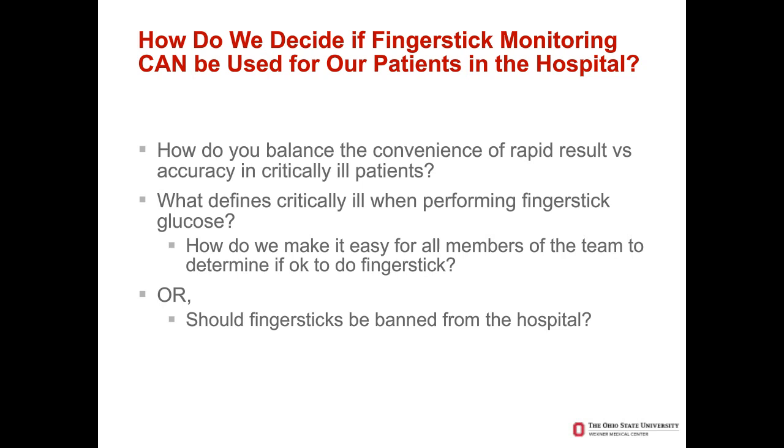I would argue that the convenience of the rapid result outweighs the idea of banning finger sticks, but we really do need a systematic approach to determining if it's reasonable and safe to do finger stick monitoring and to take therapeutic actions based on those results.